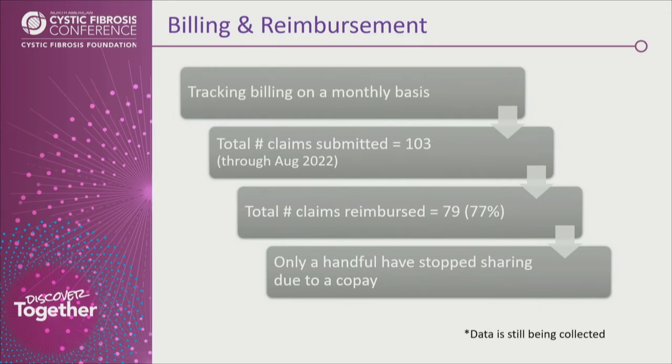The good news is that only a handful of patients have stopped sharing their results over the dashboard due to having a copay or their insurance not covering it, so that's good news. And then lastly, in terms of overall reimbursement amount, so far with billing, we've been able to cover the cost of the dashboard and generate some revenue.